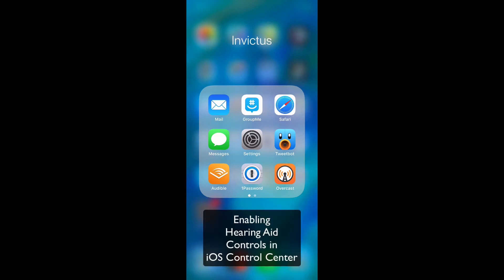Hi there. We're going to take a very quick look at how to add hearing aid controls to the control center of your iPhone.